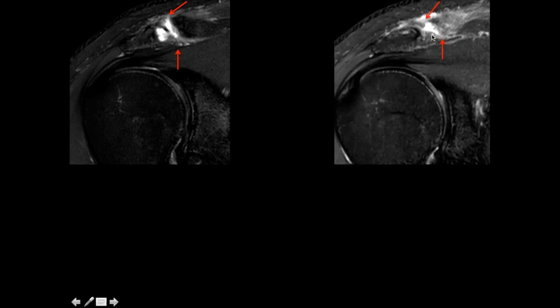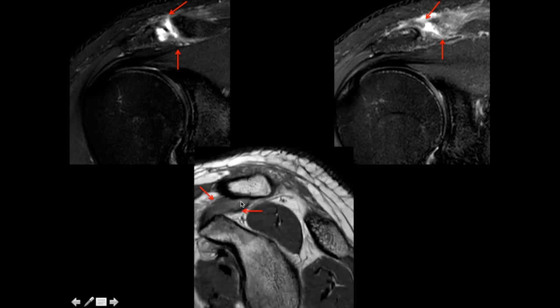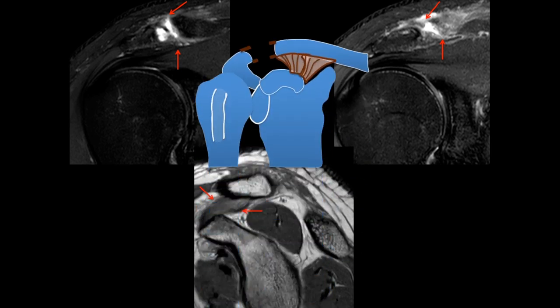In this next patient, the AC ligaments are torn — at least the superior ligament is torn on one coronal image, and the inferior ligament is also torn on another. On the sagittal image, the coracoclavicular ligament is intact but bulky and edematous — it is sprained but not disrupted. This is torn AC ligaments with a sprained CC ligament: Type 2.